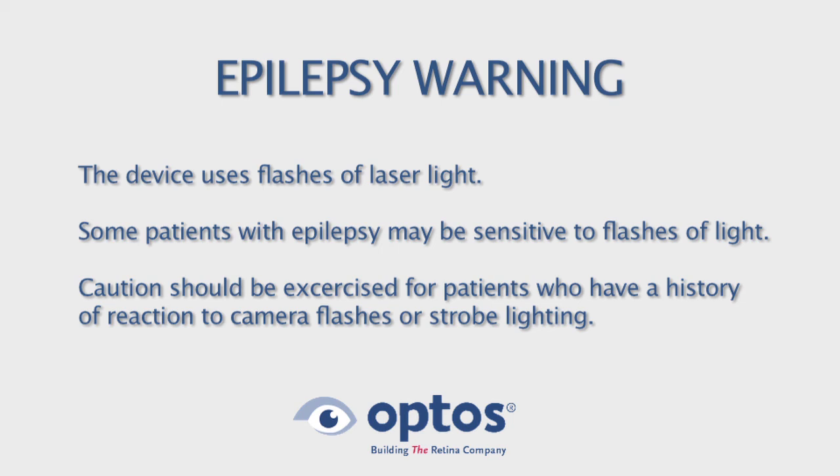The device uses flashes of laser light. Some patients with epilepsy may be sensitive to flashes of light. Caution should be exercised for patients who have a history of reaction to camera flashes or strobe lighting.